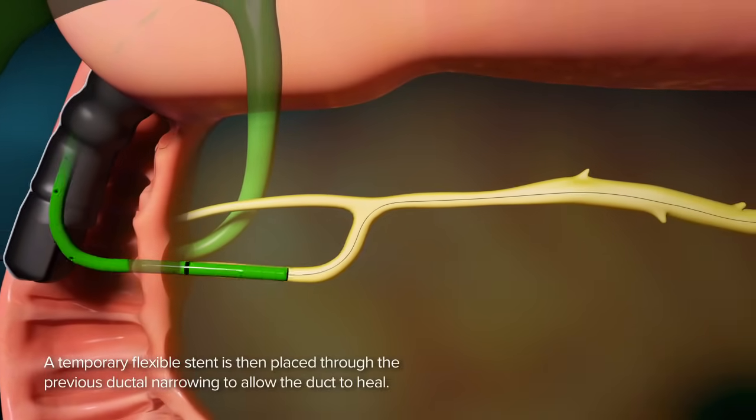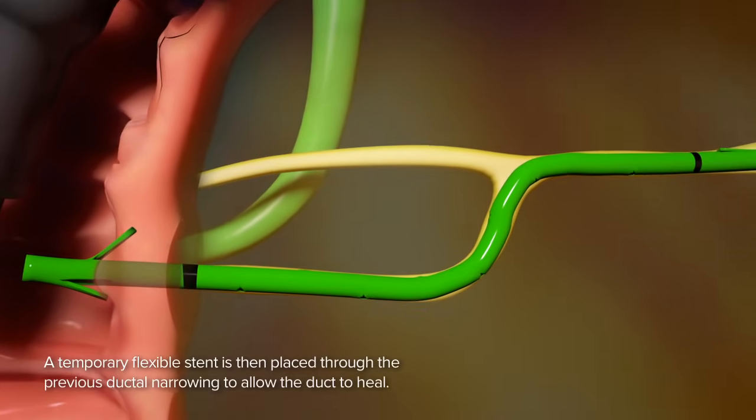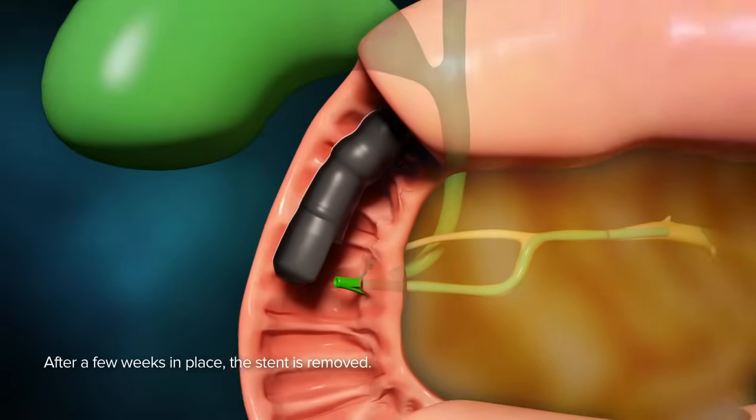A temporary flexible stent is then placed through the previous ductal narrowing to allow the duct to heal. After a few weeks in place, the stent is removed.